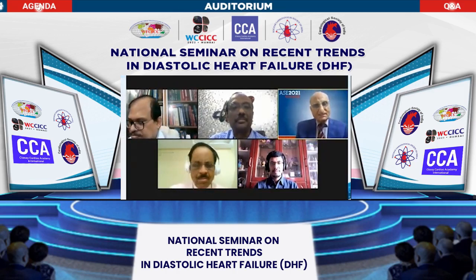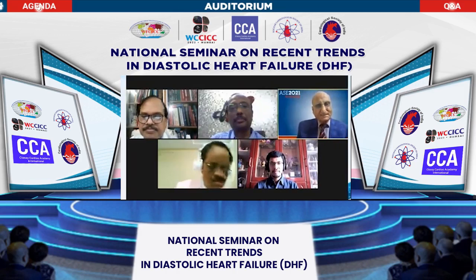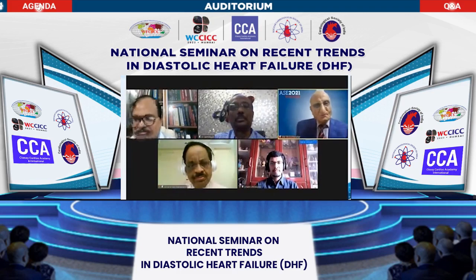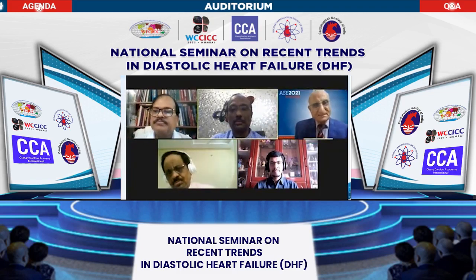And as I told you, I had no time to show that slide. One single slide always covers the difference between constrictive pericarditis and restrictive cardiomyopathy, which is the main diagnostic problem also. We have taken the help of a CT for pericardial thickness, but most of the other echo signs are usually very well seen, though no one single finding is diagnostic. It is a combination of findings which should be seen rather than one single finding.